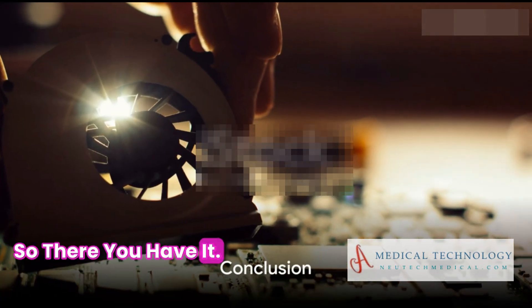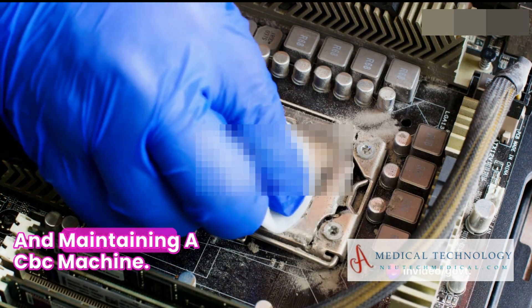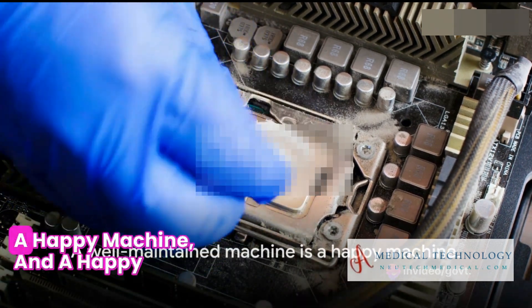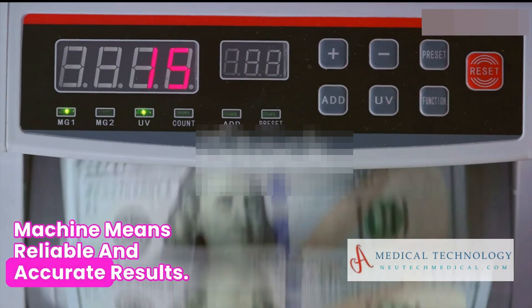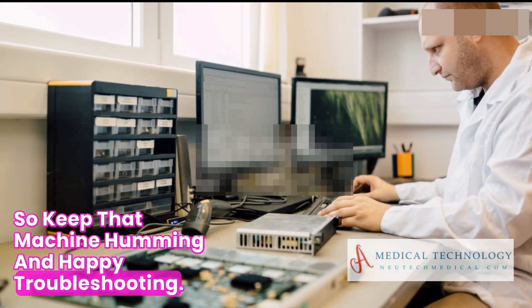So there you have it — your quick guide to troubleshooting, repairing, and maintaining a CBC machine. Remember, a well-maintained machine is a happy machine, and a happy machine means reliable and accurate results. So keep that machine humming, and happy troubleshooting.